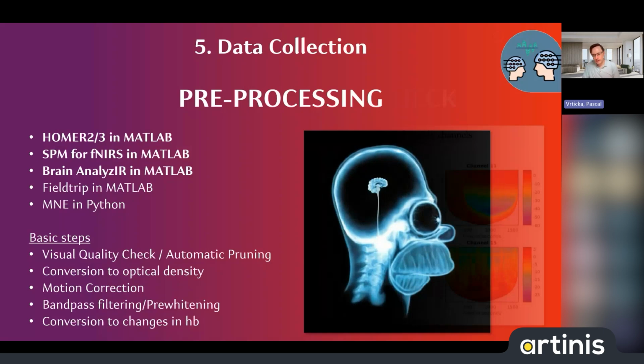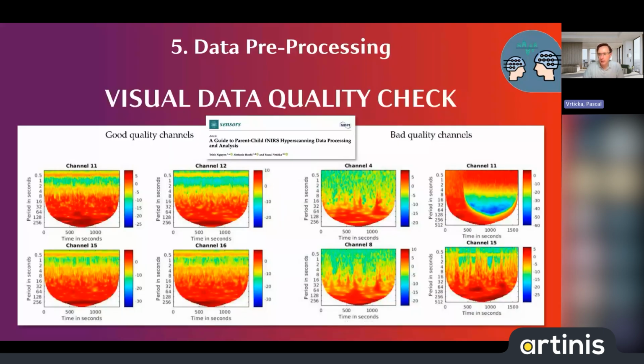One thing that we think is really, really helpful is that very soon after you have acquired the data, and before you do any fancy automated analysis, you actually do a manual visual data check. And this is really simple, because all you have to do is, for each participant, derive a time by frequency plot for each channel.